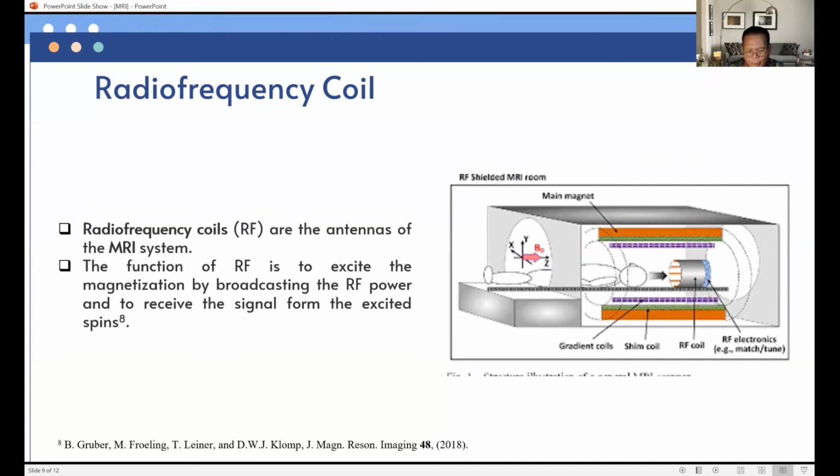Radio frequency coils are an essential MRI hardware component. They directly impact the spatial and temporal resolution, sensitivity, and uniformity of MRI. Advances in radio frequency hardware have resulted in a variety of designs optimized for specific clinical applications.